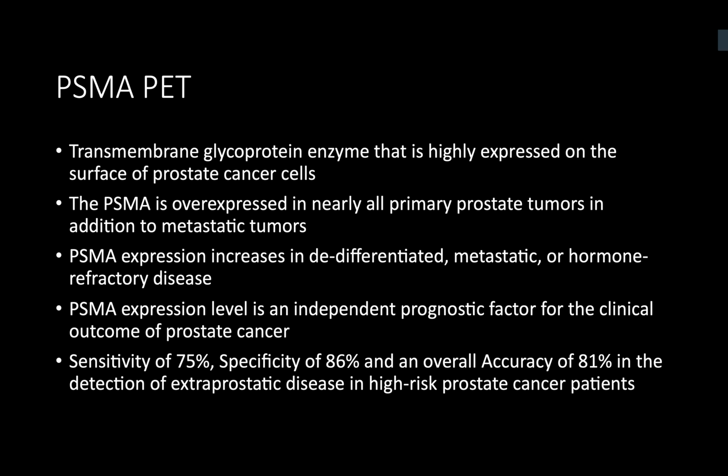Because PSMA expression increases in undifferentiated tumors, metastatic tumors, and also in hormone refractory tumors, it is very much useful in the prostate cancer scenario, especially for the primary diagnosis, for biochemical recurrence, and even to diagnose a hormone refractory state. And it has good accuracy of around 80% in detecting extraprostatic disease.